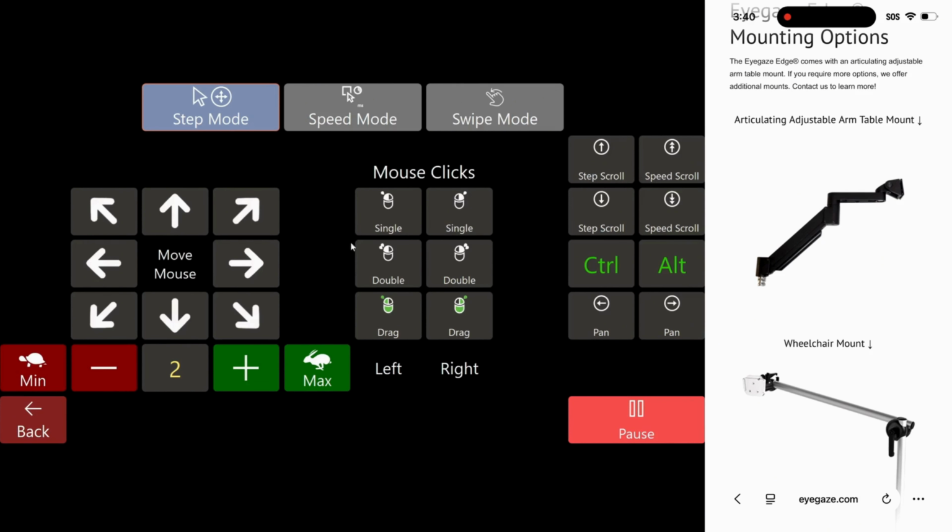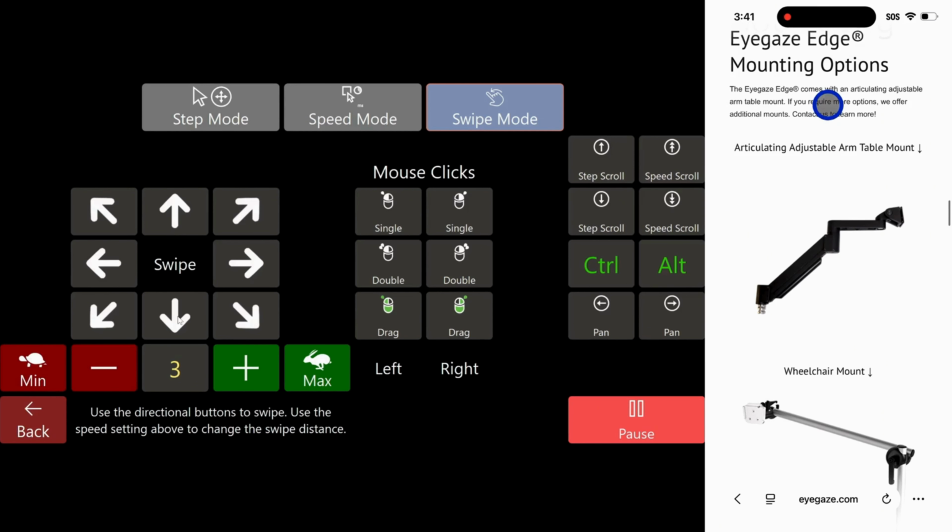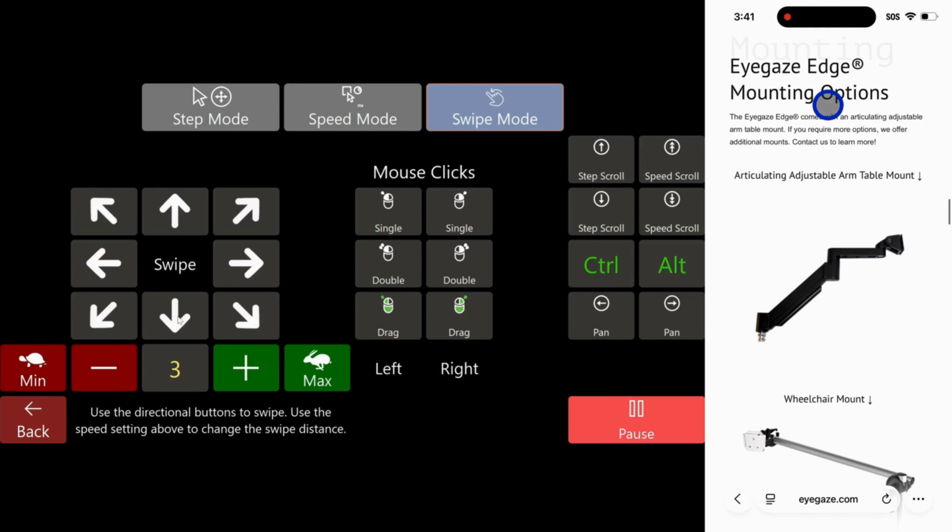Here, we will show you swipe mode, different from Step Scroll Up. First, move the cursor to the top center of the iPhone screen and select swipe mode. Let's say you want to scroll up. When using your fingers, you would touch the screen near the top and move downwards. Since swipe mode is similar to touching and dragging, to scroll up, you would swipe down. You can see that it's scrolling up a little at a time.